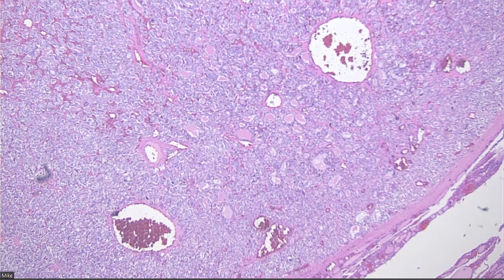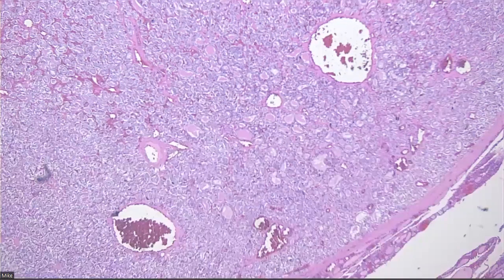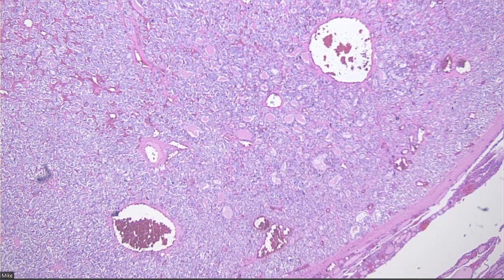Okay, so case one is a 31-year-old female with left thyroid nodule, 2.7 centimeters on ultrasound, solid appearing papillary carcinoma on FNA. They're mostly going to be follicular patterned neoplasms, because I think the differential diagnosis for these is tricky. Classic papillary is classic papillary, so we're not really going to talk about that. We're going to talk about variations on follicular patterns. When applicable, I think it's important to look at the ultrasonographic features and placement, and then the FNA, because you want to know that you're answering their question, right?